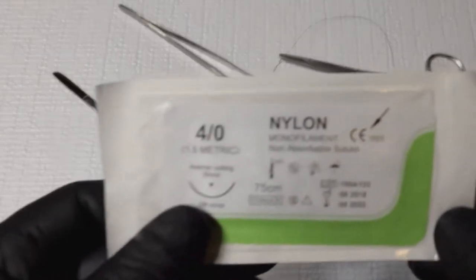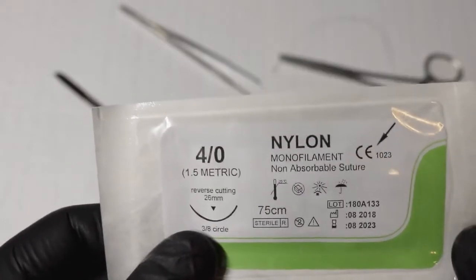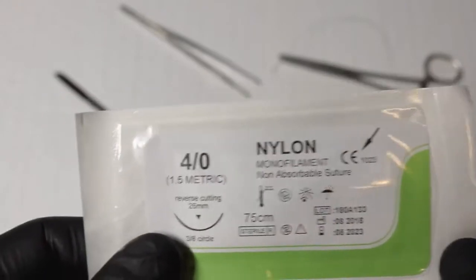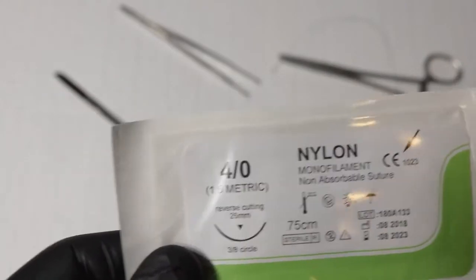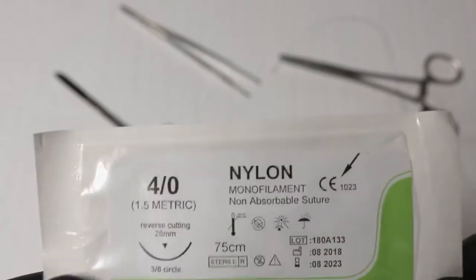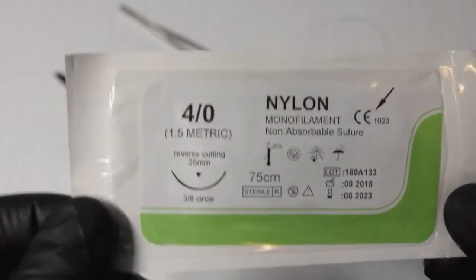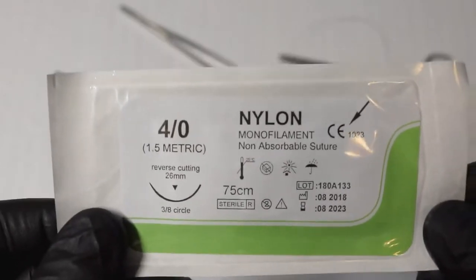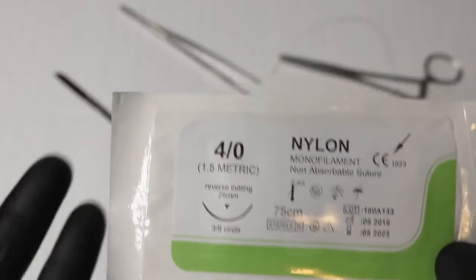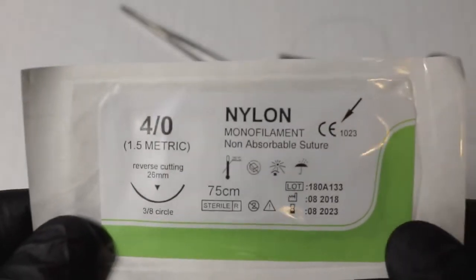Now for the suture material itself, there are different types that can broadly be categorized into four categories: non-absorbable, absorbable, braided, and non-braided. Non-absorbable sutures are the ones that don't dissolve in the body, so they have to be removed — you need to go back to your doctor to get them taken out. Absorbable sutures are recognized by the body's tissue, absorbed naturally, and can be left in.